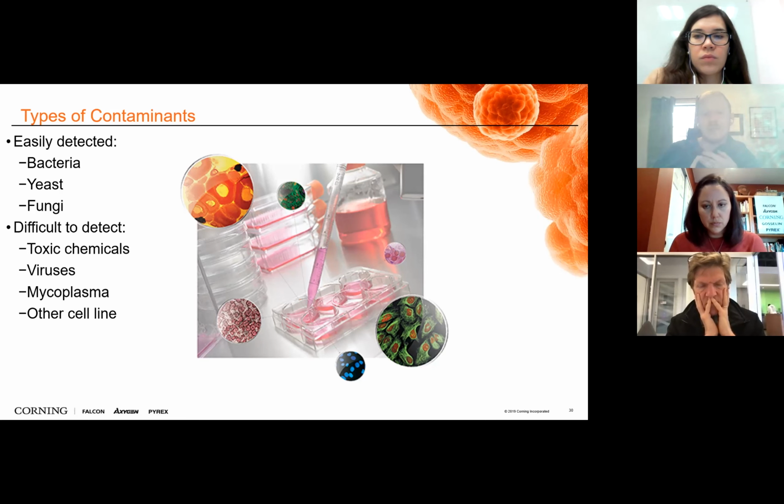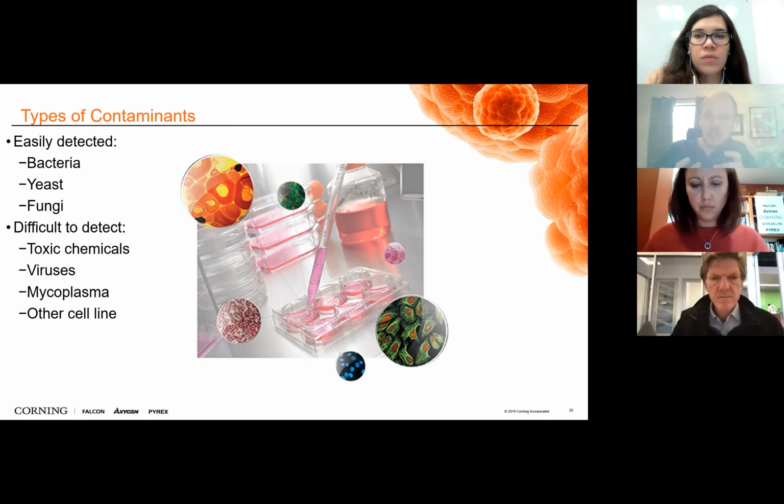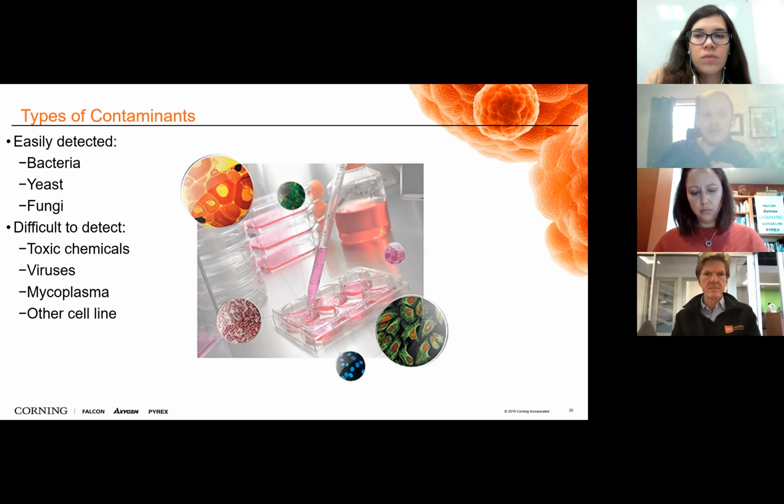And so sometimes people don't actually realize that you can cross-contaminate your cell lines, and it's often very hard to actually identify that just by looking at the cells growing in the dish. So it's important to maintain aseptic technique, even when you're working with different cell lines, to not cross-contaminate those.